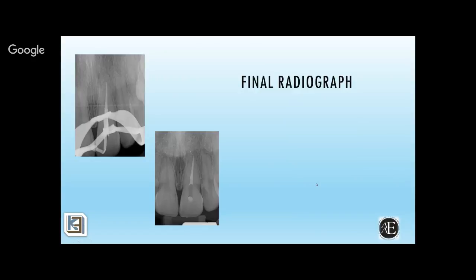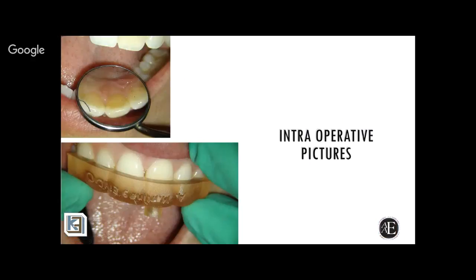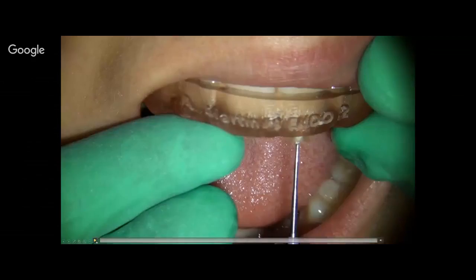Now, these are intraoperative pictures that put all this together for you. This picture up on top here presents the case before I even started drilling. This one with the guide on shows the guide hole tube extending from the top. And this is actually a video of the actual drilling through that tooth. Now, as we're watching this, watch at 3 minutes and 30 seconds, I will pop into the canal and you will see it clearly on the video.